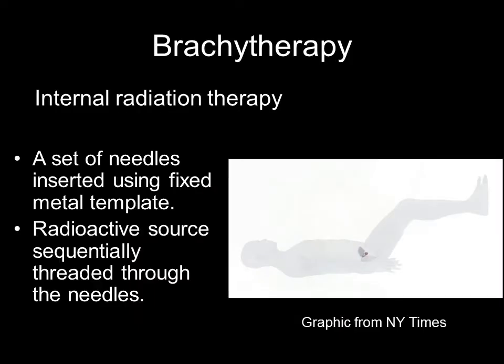Brachytherapy is a type of internal radiation therapy. This is used for treatment of tumors in various body sites like cervix, breast, lung, prostate, and urological cancers. Our study focuses on the application of algorithmic techniques on prostate cancer. However, these methods are equally applicable on other organs as well.